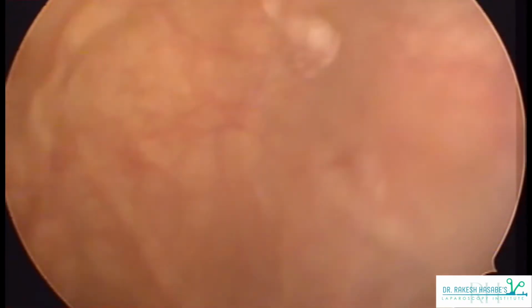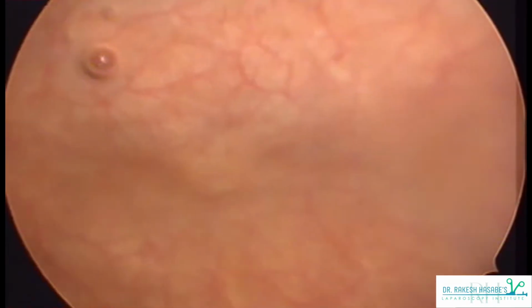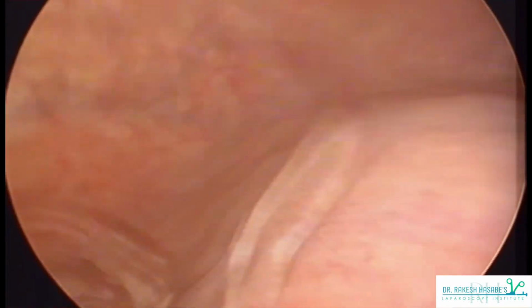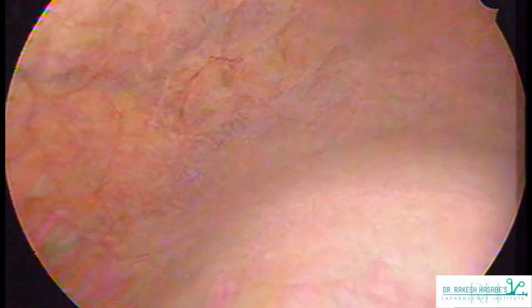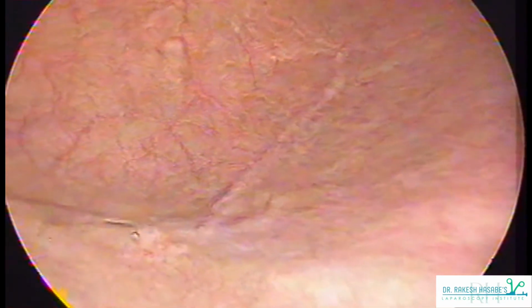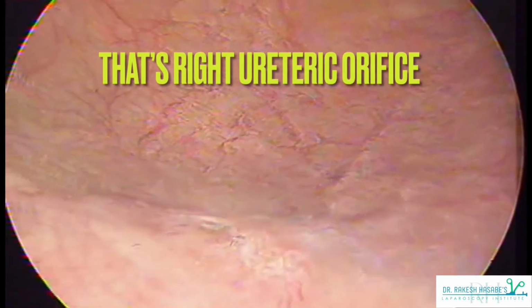Patient's privacy is maintained. So every gynec should be well versed with performing this cystoscopy procedure, because commonly we need to evaluate the bladder pathologies or bladder involvement in cases like cervix, and not always will you have urologists at your setup available for performing diagnostic cystoscopies. So one should always be well versed with performing simple procedures like diagnostic cystoscopies, and even be able to take biopsies when needed.